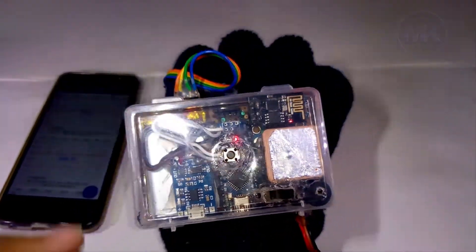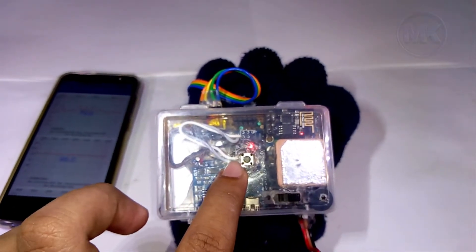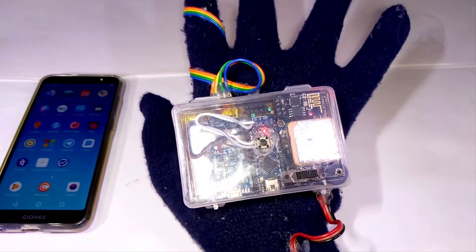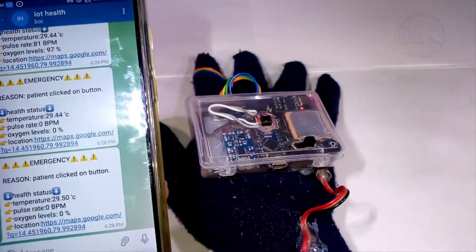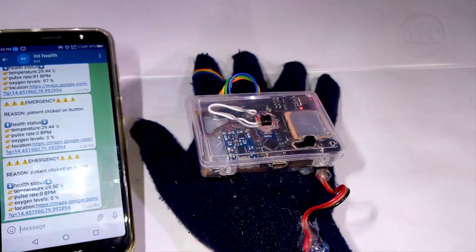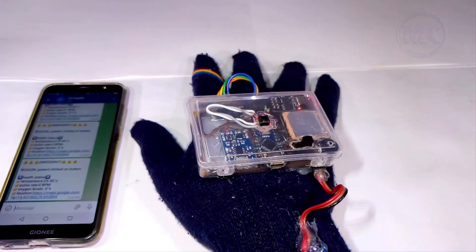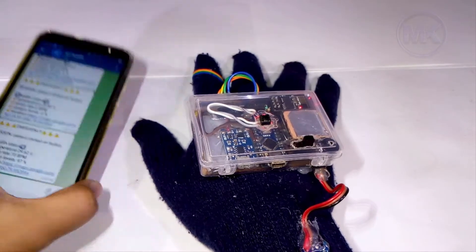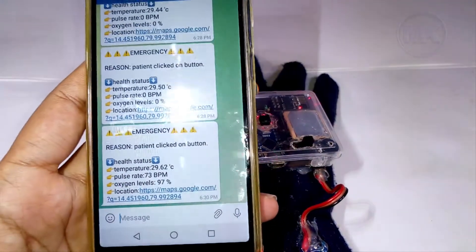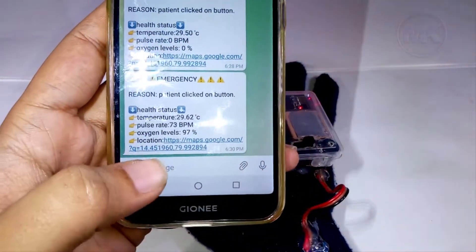This glove has a special feature — an emergency button. Whenever a patient feels uncomfortable, they can press this emergency button, and within seconds a message will be sent to Telegram. As you can see, whenever I press this emergency button, a new message is received in Telegram.